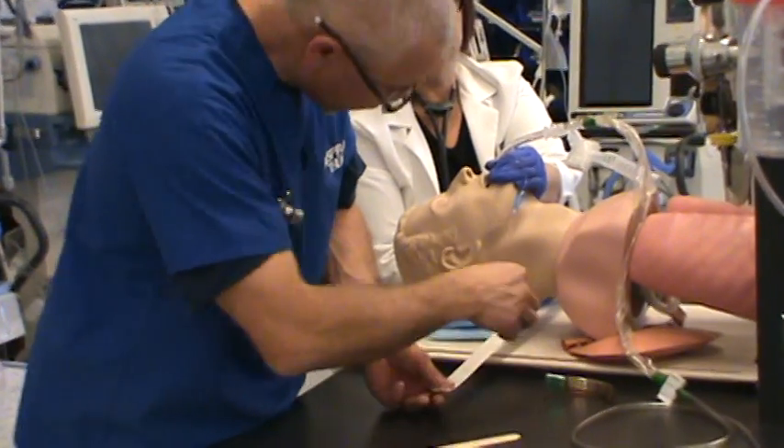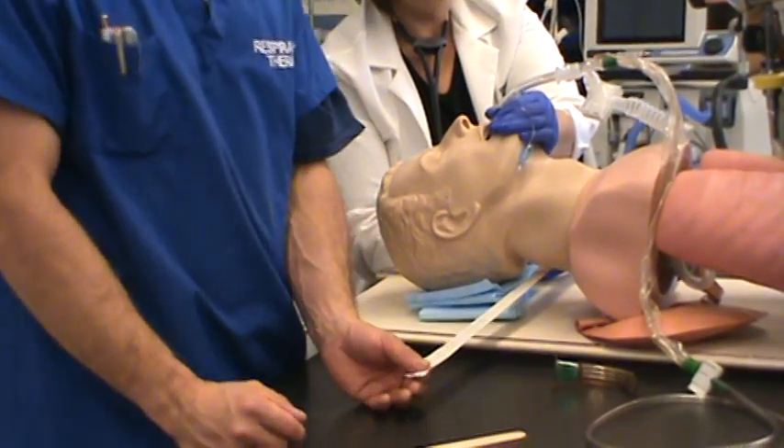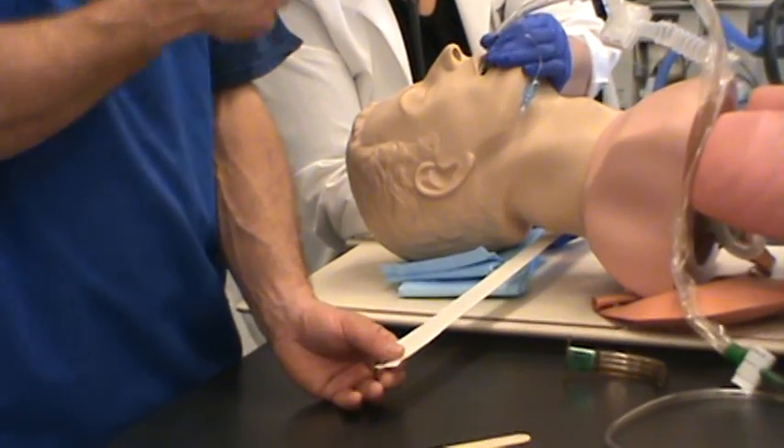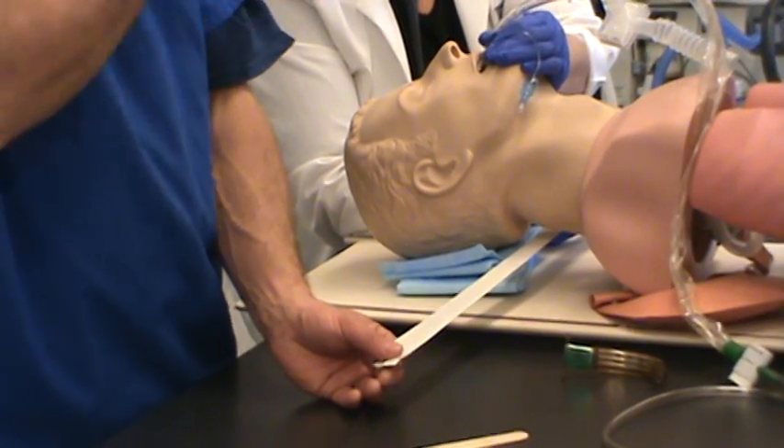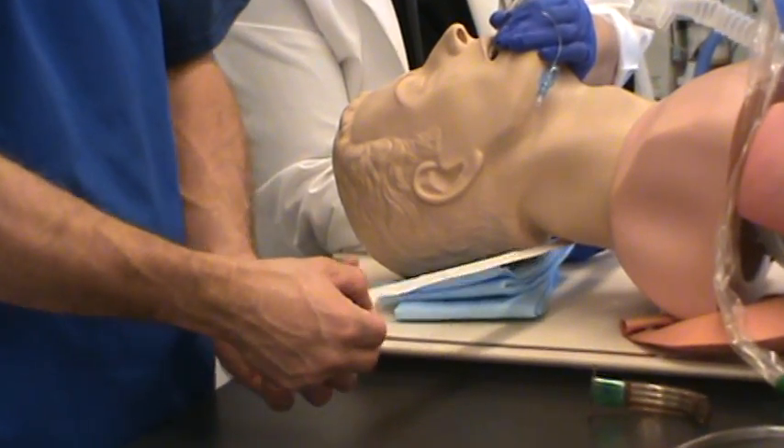The assistant's role is to ensure that ventilation is going on, the tube is secure, and they're holding onto the tape. They've got a really, really important role to perform while you're doing this.